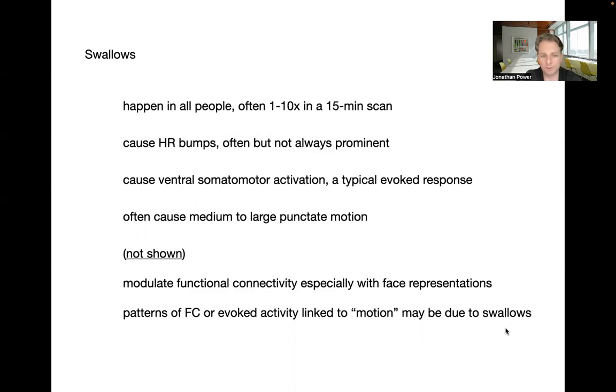The things I didn't show you, just for time, is that swallows modulate functional connectivity, especially with representations of the face. And I alluded to this, but didn't really lay out the full logic a moment ago, that the patterns of functional connectivity or evoked activity that we have linked to motion may, in part, actually be due to swallows and not directly attributable to motion.